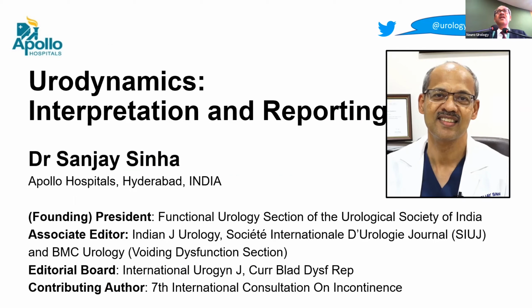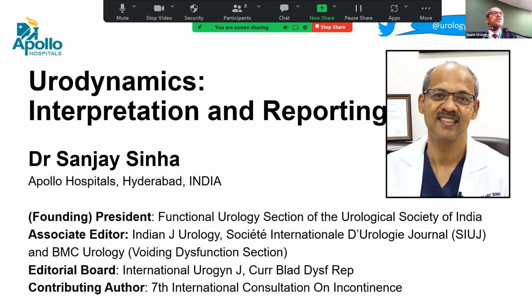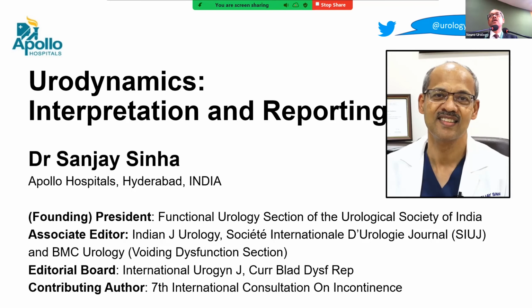I must confess, in this presentation, I am not going to be giving you the A to Z of how to interpret and how to report. I'm going to focus, through 4 clinical cases, on what the pitfalls are and how you report, and perhaps through that give you the idea that you need to practically interpret your patient's reports.